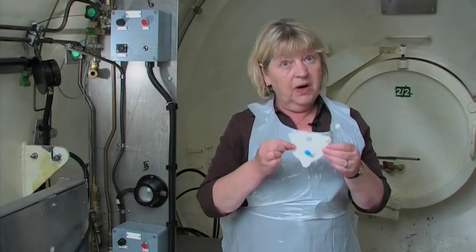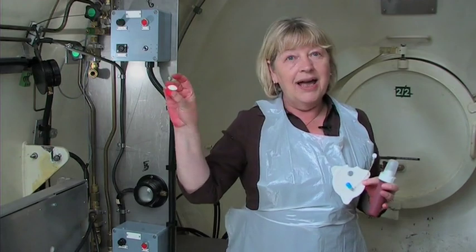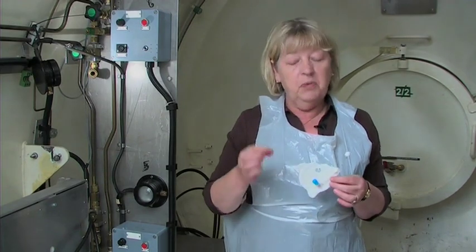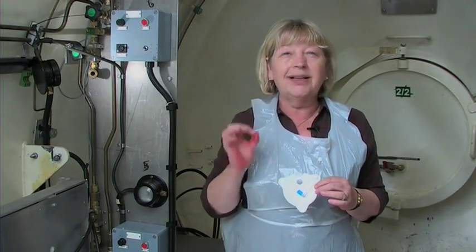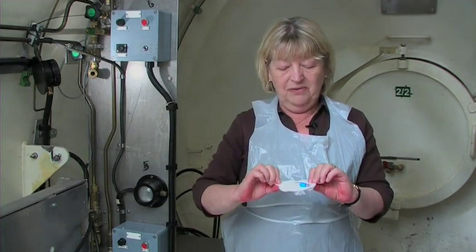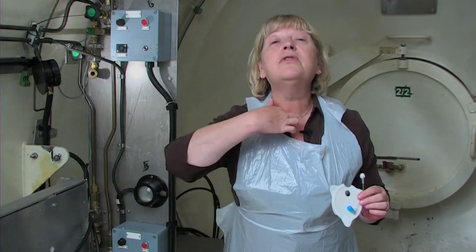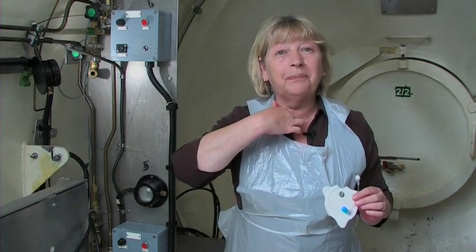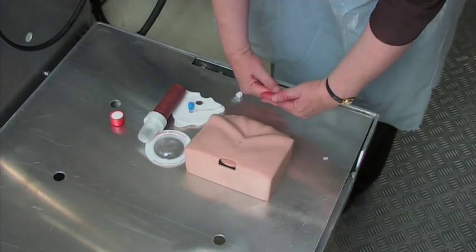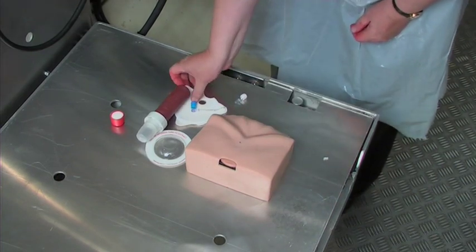We also need a target patch, the gun itself, and the sharps disposal. Since it's so important that we get the cannula in exactly the right place, the target patch has been devised. This curve here fits into the notch that we all have here. I want you to imagine that I am standing at the patient's head. Here is the sternal notch that I pointed out.